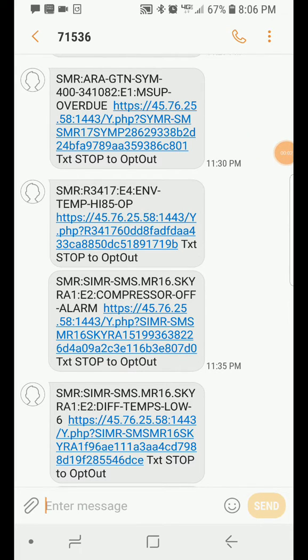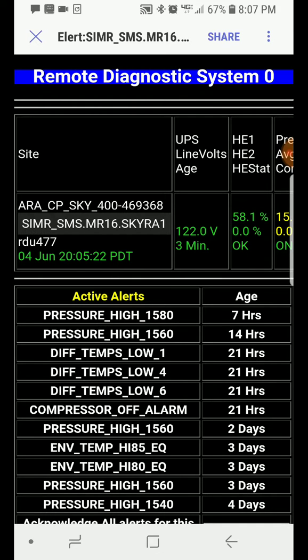This is a video on how to manage a differential temperature low alert on a Siemens MRI system. So this alert came through last night. It comes with a clickable link, which you will click on. It will take you to the green board view of just this one site.